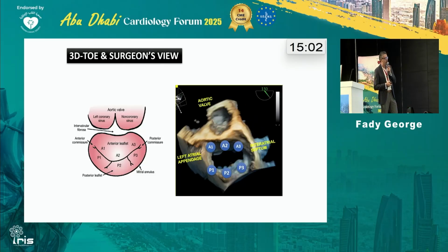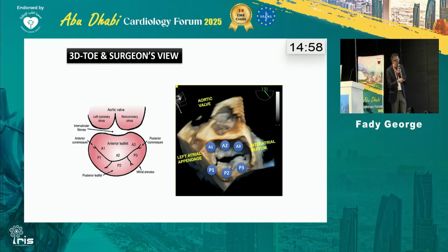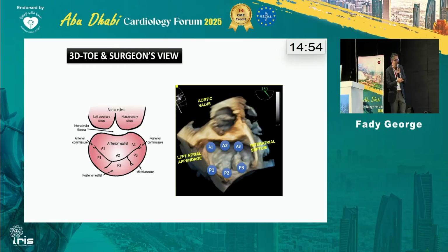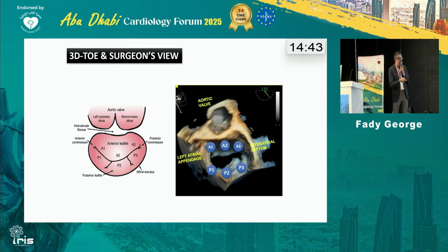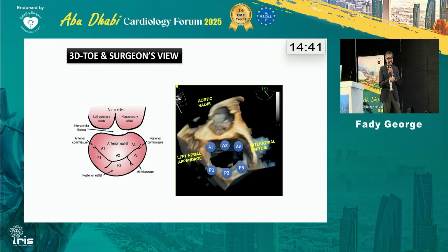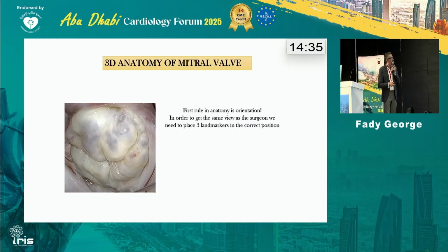Wonderful. It's basically P2, P3. That's right. And you can see here the chordae tendineae, this small structure, it's completely ruptured. That's why the scallop is prolapsed and completely flailed. Flailed means there is no attachment anymore with the annulus or the leaflet of the valve. And that can cause, for example, a severe eccentric mitral regurg. And that's what needs repair for sure. So that's a very good guess.